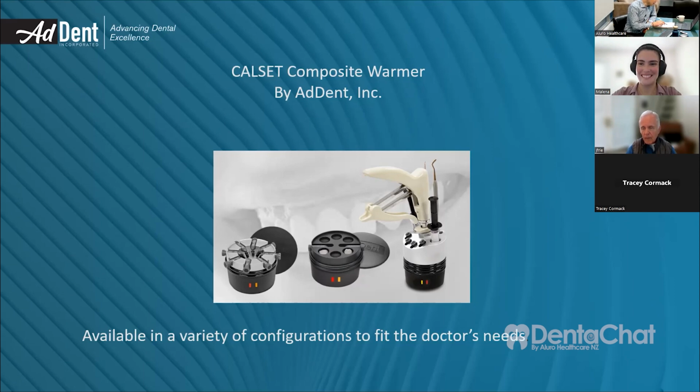Now, the other question I had about this is we did have once upon a time somebody who put them on the autoclave, and I understand you can put the tray on the autoclaves. Yes. And obviously the base is just cold. Well, the base has electronics. You cannot autoclave the base. You can wipe it down with a surface disinfectant, but the trays are completely autoclavable multiple times.